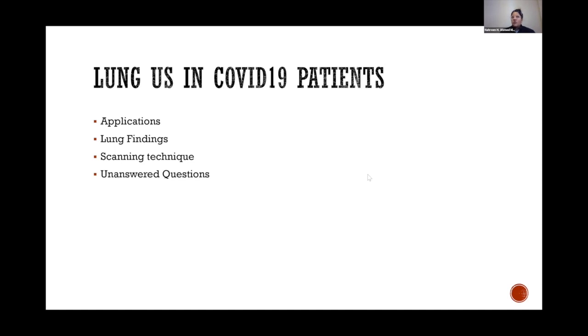The problem with doing hands-on training, so certainly if this whole pandemic wasn't happening, I'd be happy to be on the ground and giving hands-on training, since that's really what I love doing. But given the current situation, you're right to ask that question on maybe how we can think about doing hands-on training via webinar, where you're on the other side with your ultrasound and I can walk you through how to scan somebody. That's probably a way to do it.